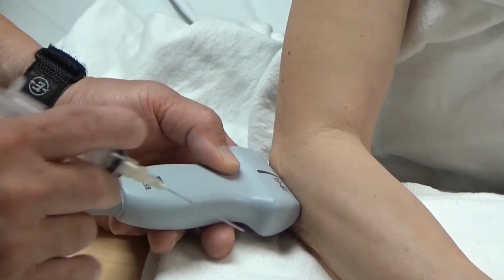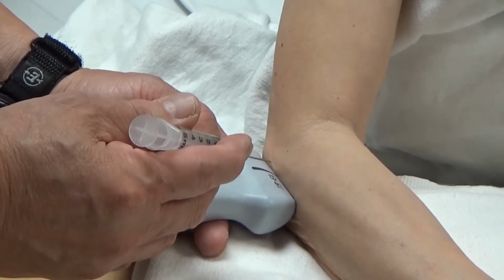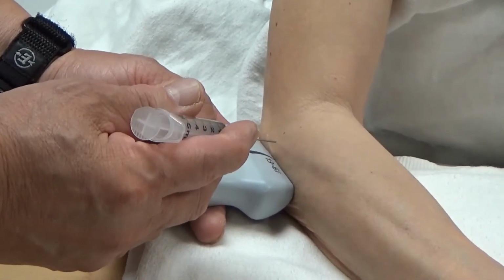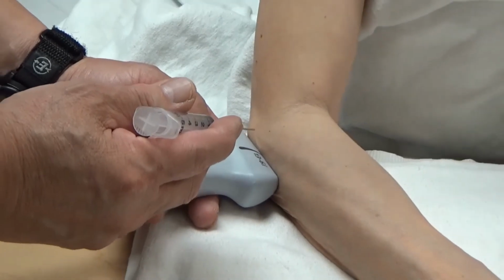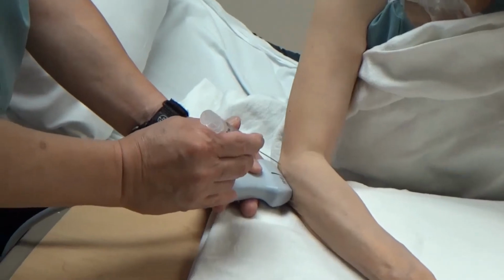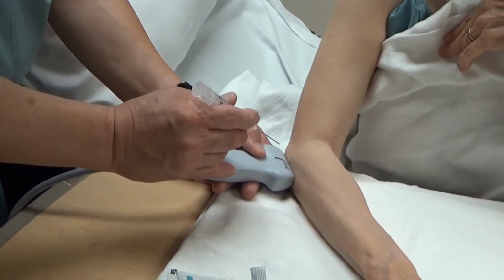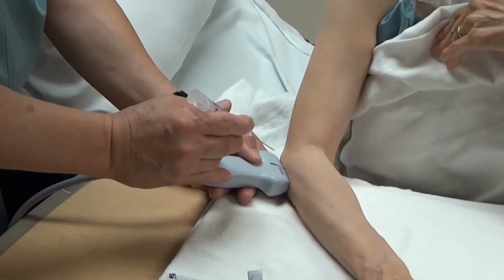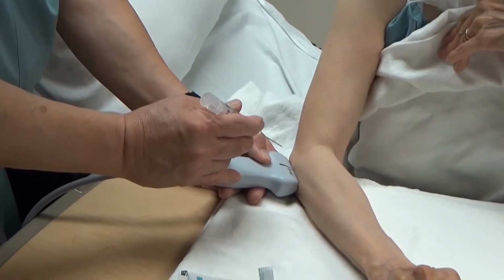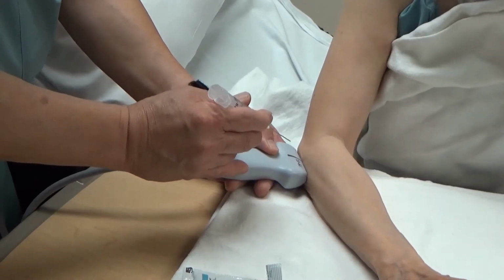And so one question people frequently ask me is, how often do you fenestrate? And so there's certainly no golden rule. However, I generally find that when you initially start, there is sort of like a crunchy sensation as you fenestrate back and forth. After about 15, 20, 25, even 30 times, that crunchiness starts to dissipate. And that suggests that much of the calcium, if there's calcium, has already been broken up, or the tendon has become adequately fenestrated.